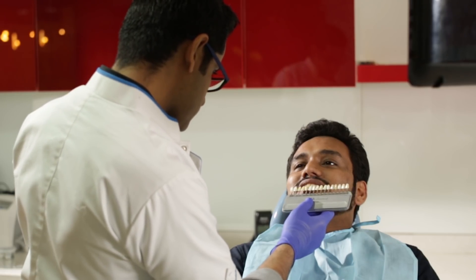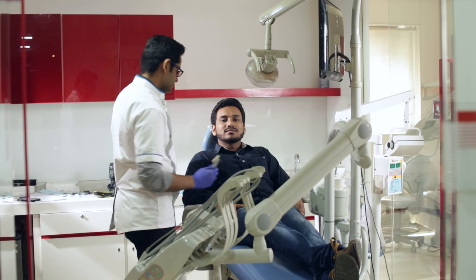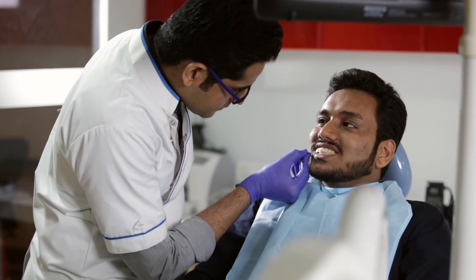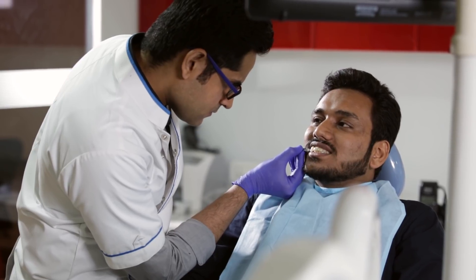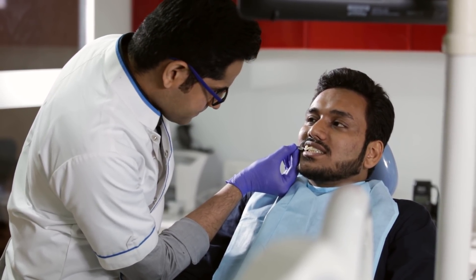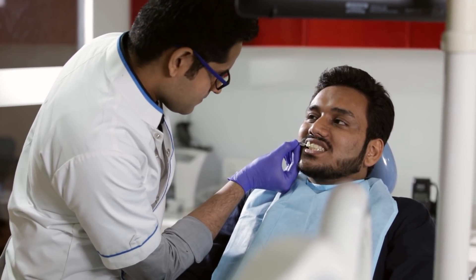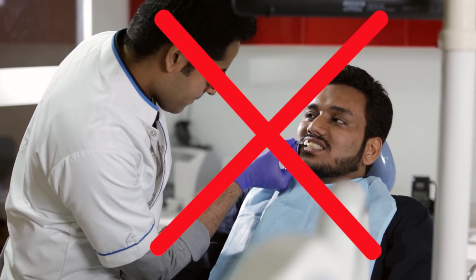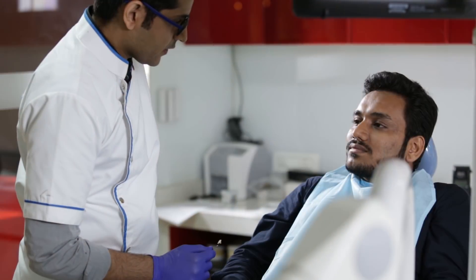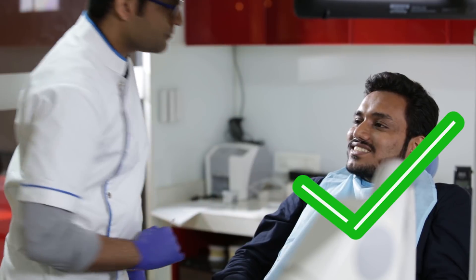It's extremely important to take the shade of the patient in natural daylight, and it's also very crucial to keep the chair light off while taking the shade. The biggest mistake dentists make is staring at the tooth with the shade guide for minutes before deciding on a shade. When we look at the tooth for very long, our retina gets fatigued and can no longer judge the shade correctly. So it's very important to be brisk while taking the shade and not spend more than a few seconds.